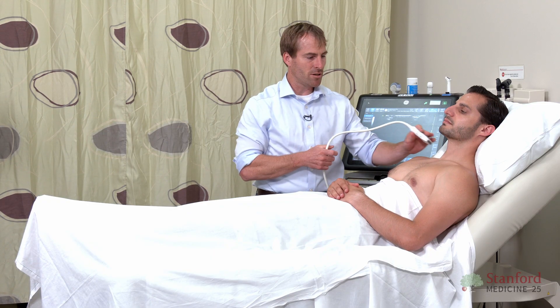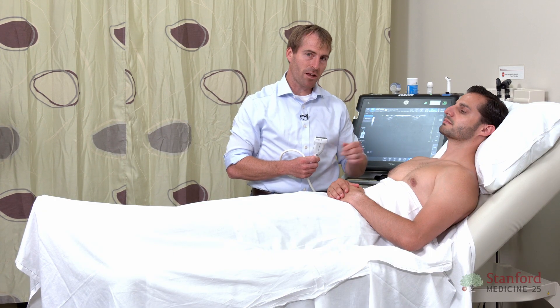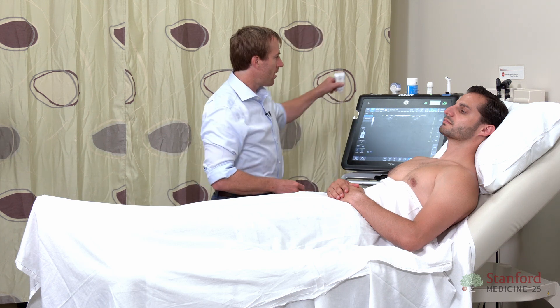We can say with certainty that our patient's neck veins are right here at his clavicle — they're not elevated. If you were unsure, we could always lay the patient down more and fine-tune this a little bit. But in almost every situation this is easy, good enough, and it only takes a few seconds to measure. So if you're struggling visualizing the JVP, think about using your ultrasound. One final note: we used a linear probe here, and you do need a linear probe to do this ultrasound well. It's not going to work with a cardiac probe — you really want a linear probe to clearly visualize the vein.